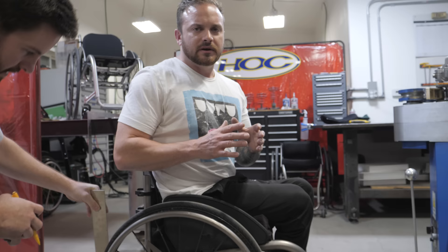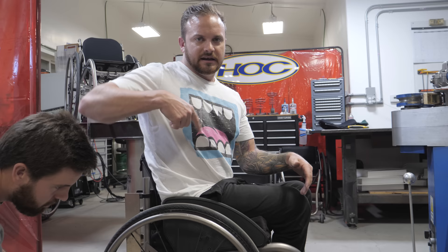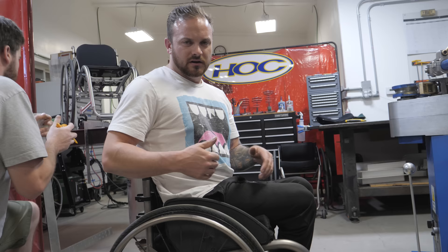We are now going to take the measurement of the overall length of chair, which is definitely important when it comes to navigating tight spaces because the length of your chair is the full radius circle of your chair. One of my gripes was that I felt like I was too short — like I wasn't in the depth of my chair. We've decided we're going to add an inch to the chair, and hopefully that will resolve that issue.